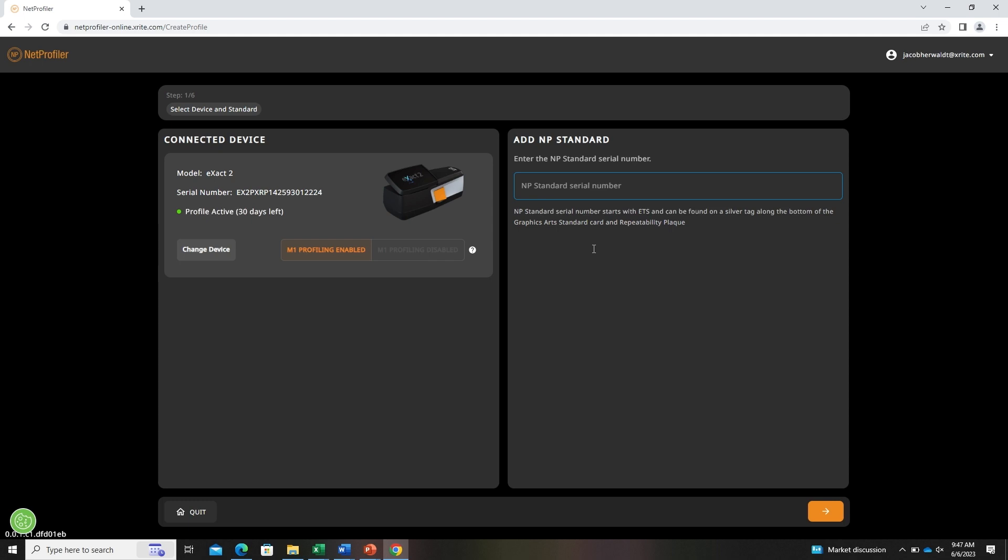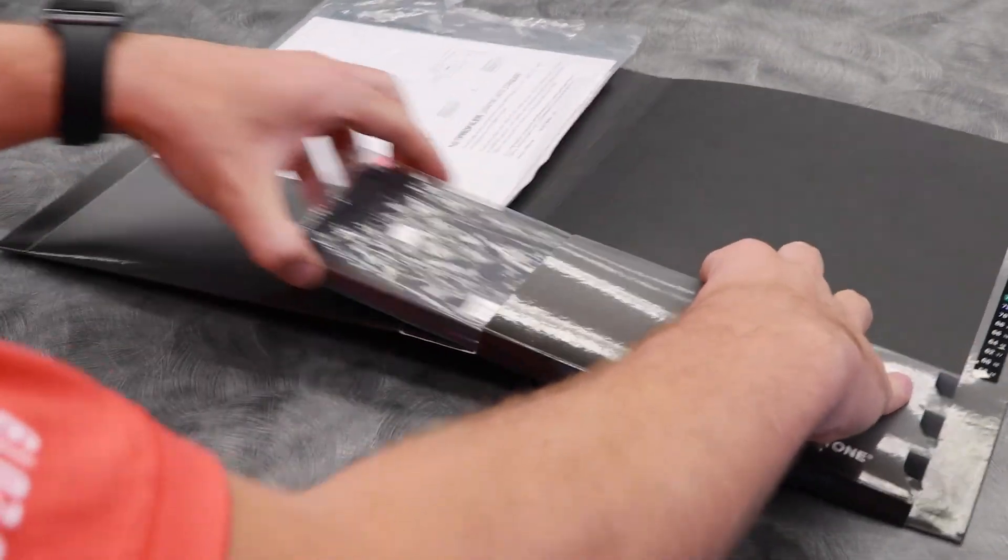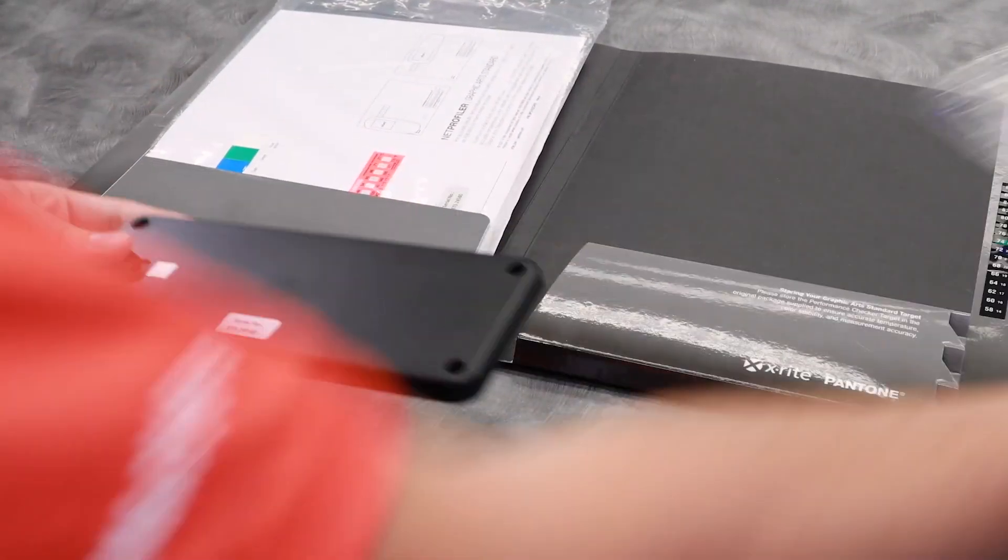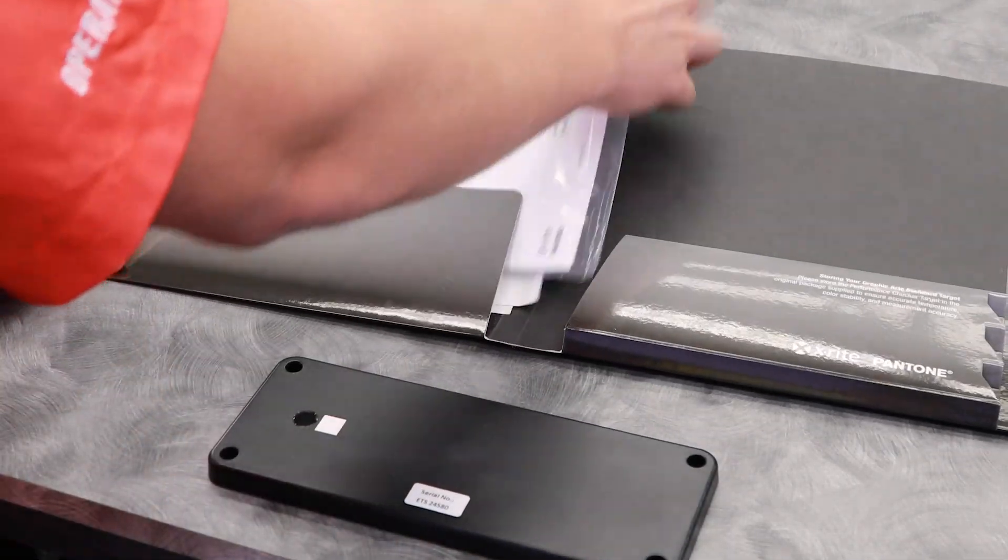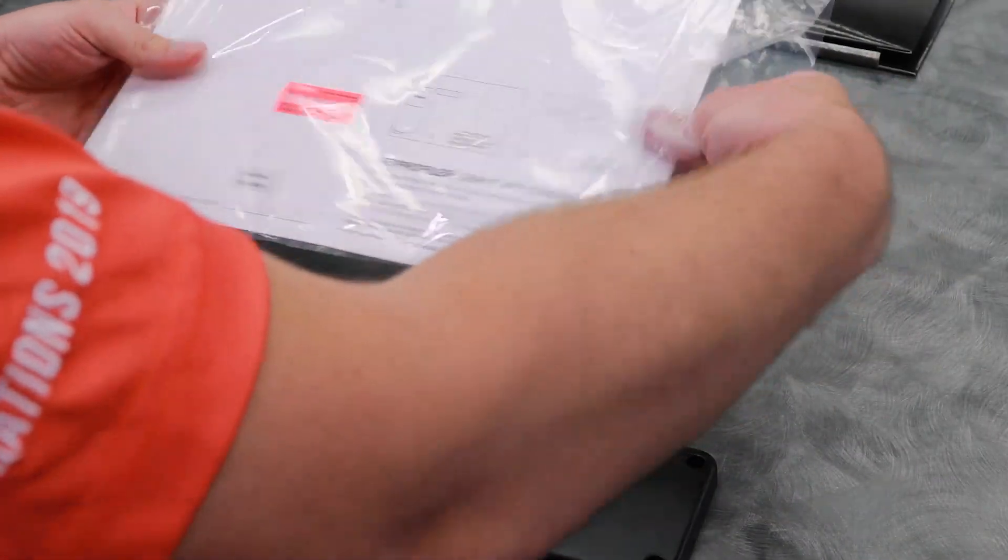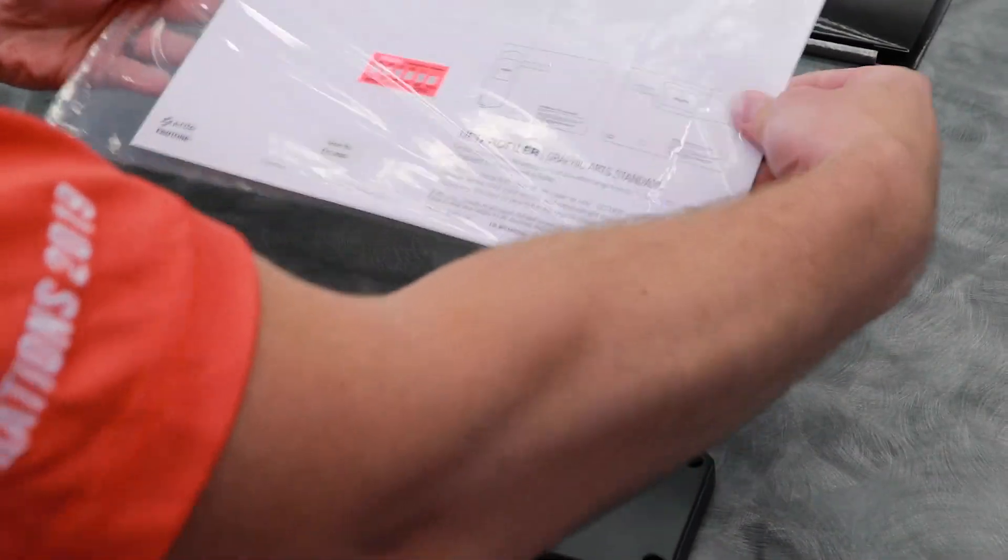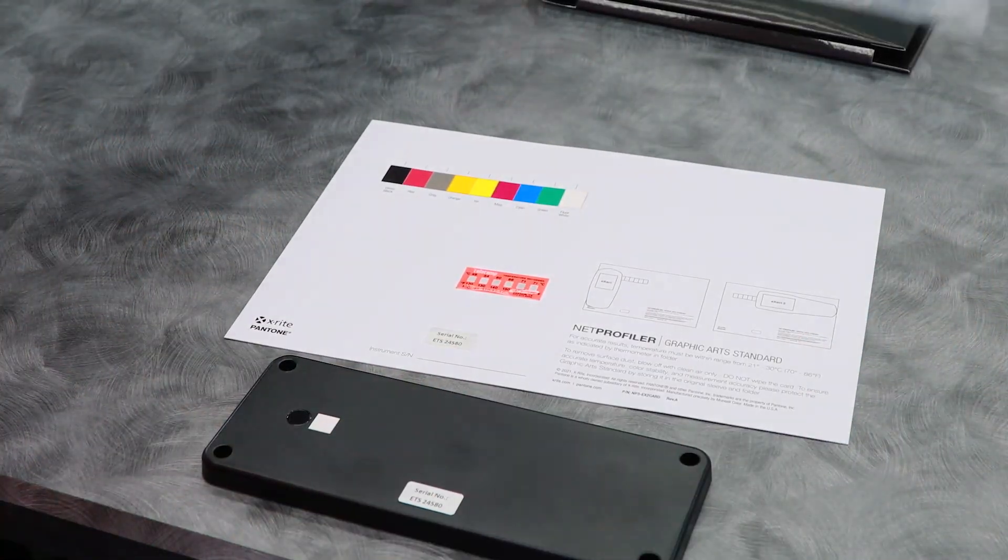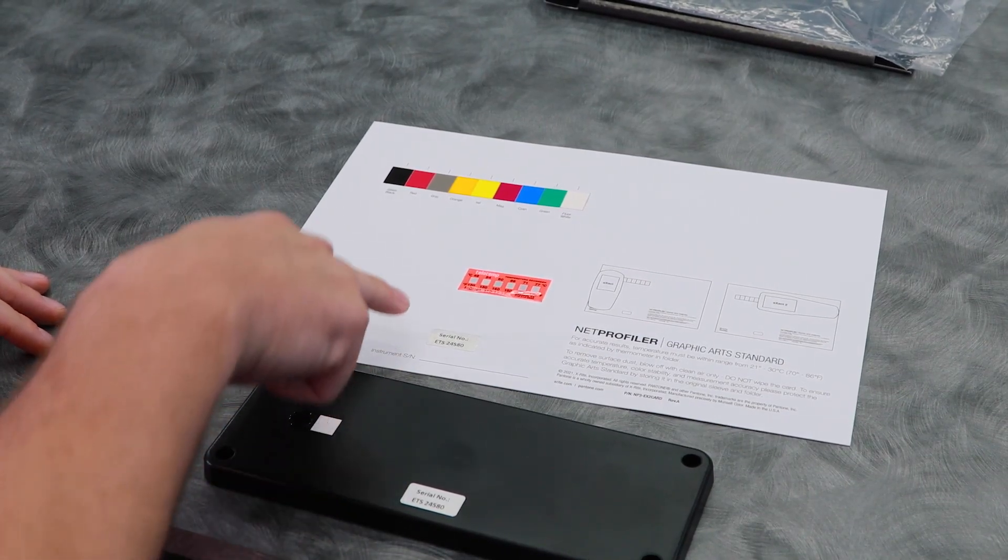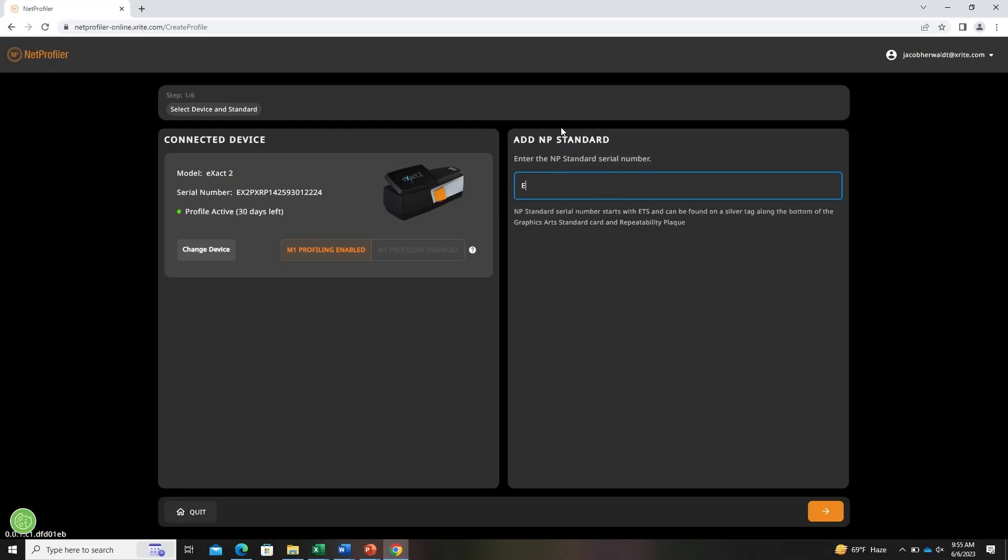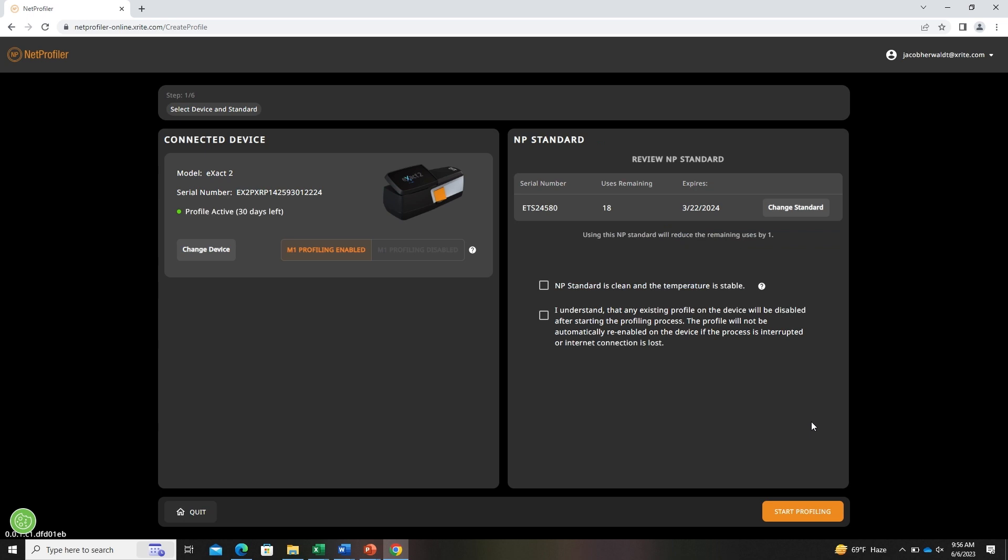Now that the device is selected, enter the serial number for the standard that you would like to use. The serial number can be found here and here. If any uses are remaining on a standard, when that standard will expire.